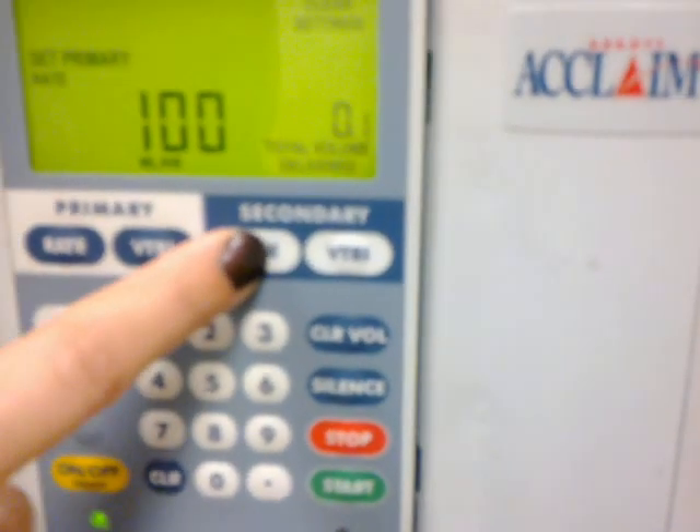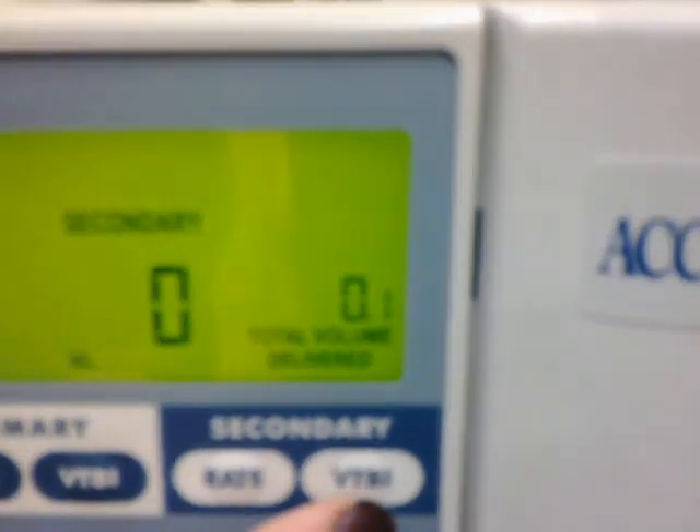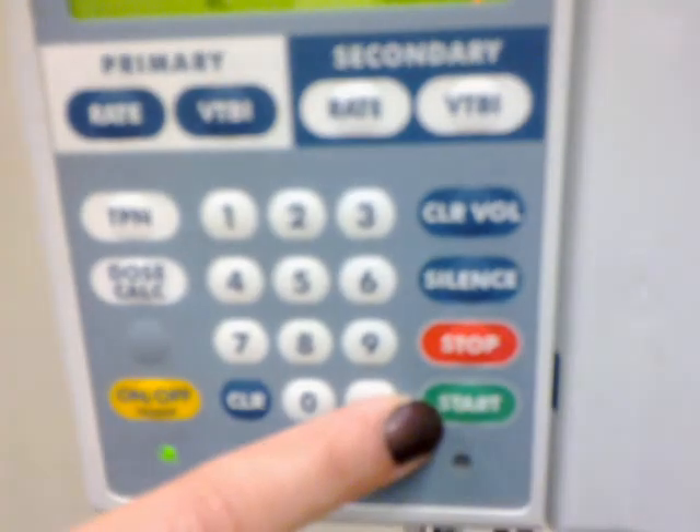Go to arm and then go to rate, because you always have to put the rate in. Punch in the rate whatever it is, and then you always have to put in the VTBI — I don't know what VTBI stands for, John told me, but I think it's volume to be infused. After that, you press start and that should be it.